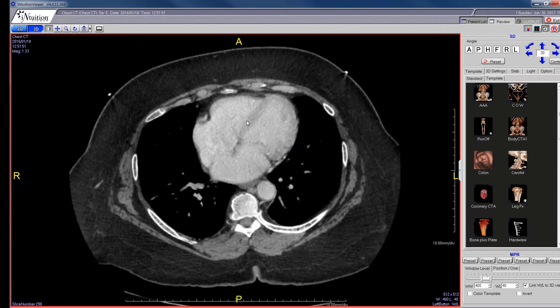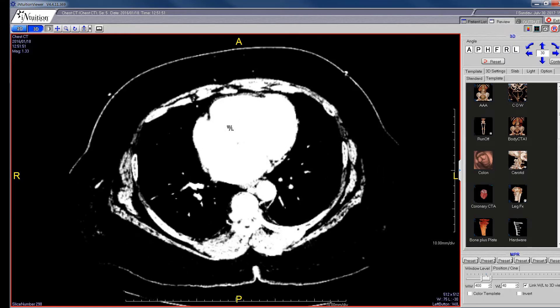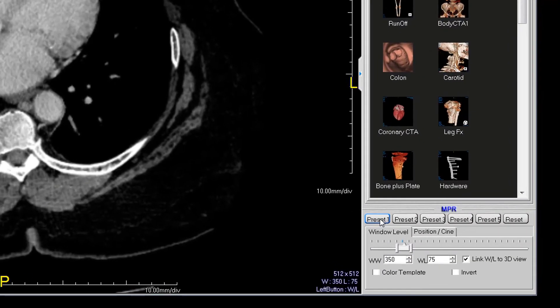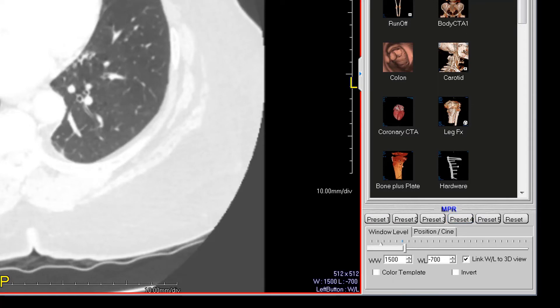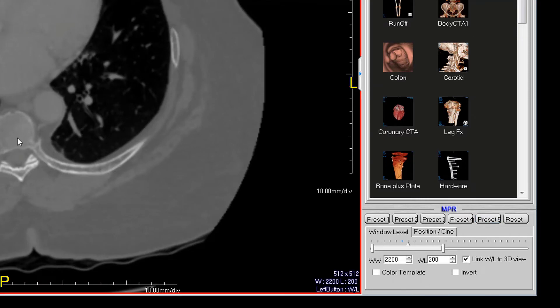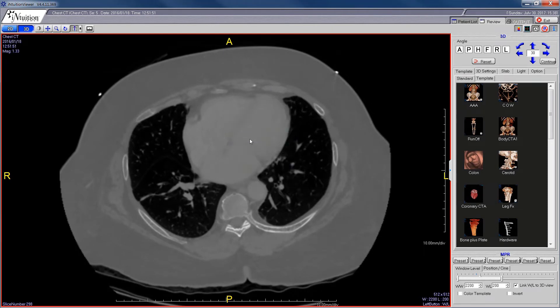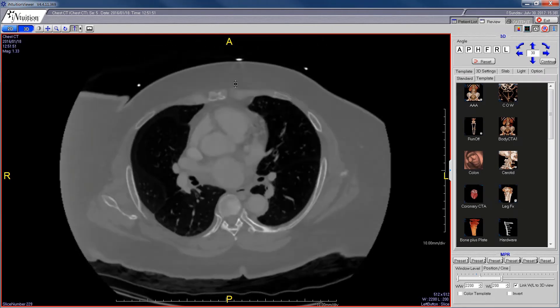Another option is the window and level selection, which lets you window and level the image depending on what type of tissue you want to better evaluate. There are a few standard presets in the bottom right corner: Preset 1 is typically used for soft tissues, Preset 4 is for the lung window so you can see the lungs well, and Preset 5 is for osseous structures so you can see the spine and ribs. I usually keep mine on slice so I can go up and down easily.